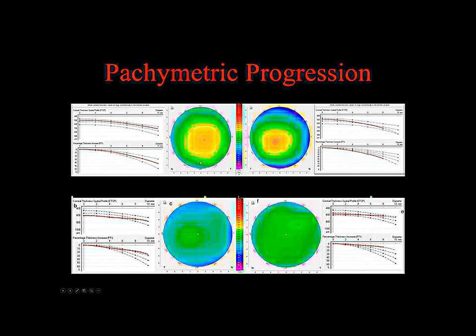And what Renato says is, I'll say it the way he does it, and I'll make it a little bit easier. He says that an eye with ectasia or keratoconus, if you start at the thinnest point and move to the periphery, it thickens more rapidly. So the rate of change is greater, which is correct. It's a little bit more intuitive if you say, if you start at the limbus, which even in eyes with keratoconus tends to be fairly normal in thickness, and you move to the thinnest point, it thins rapidly. So there's a greater rate of change.